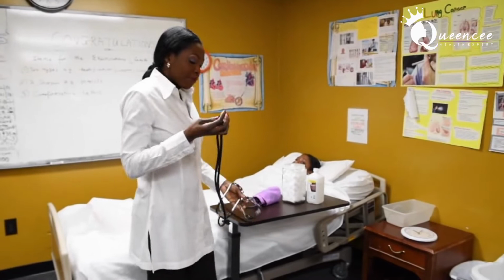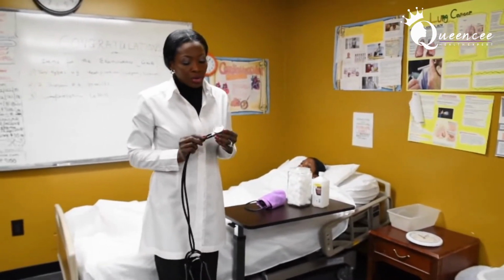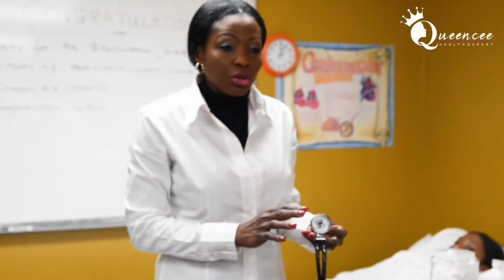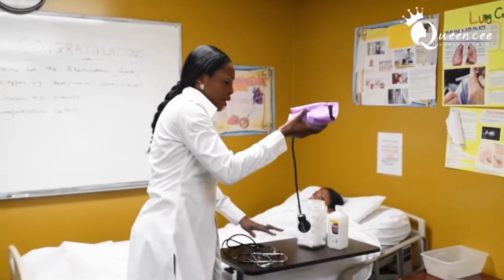Okay. But before I go any further, although I know your instructors taught you this, when you take a stethoscope, we said this is the diaphragm. This is the part that you're going to be placing on the brachial artery. So you're going to disinfect the diaphragm, and you would also disinfect the two earpieces. It's not the examiner's responsibility to disinfect the earpieces. You would disinfect it and hand one to her and keep one as well.